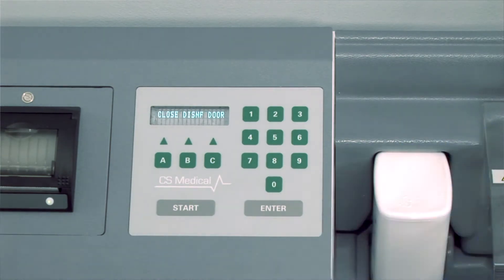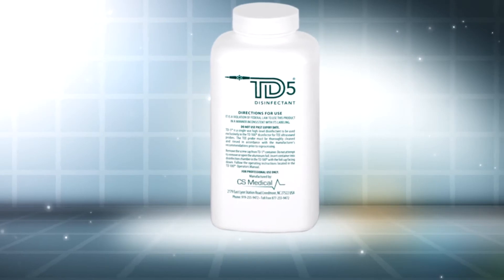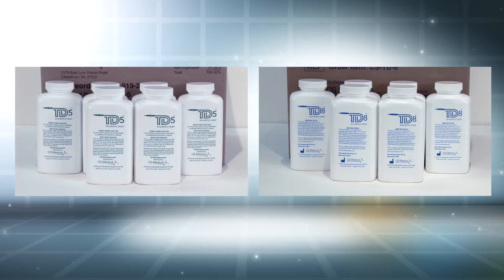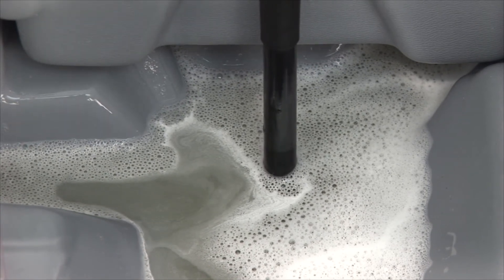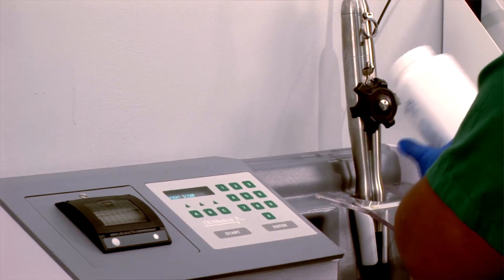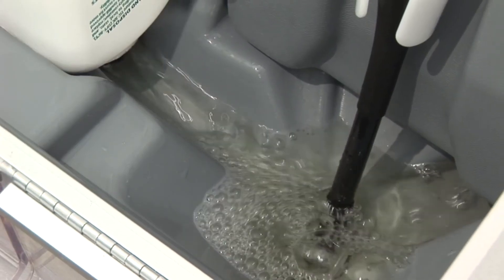While the TD100 is processing the TEE probe, let's discuss the two options of high-level disinfectant. TD5 is a single-use activated glutaraldehyde-based disinfectant, and TD8 is a single-use activated OPA-based disinfectant. Both are specifically designed for use with the TD100 and your TEE probes. The TD100 uses a fresh bottle of high-level disinfectant for each disinfection cycle, eliminating the need for MRC testing. Single-use is important as it eliminates the risk of employee error that occurs with reusable disinfectants. The high-level disinfectant bottle is pierced inside the TD100, thus minimizing the potential for splash, spills, and vapor exposure.